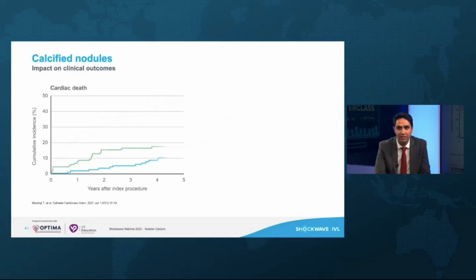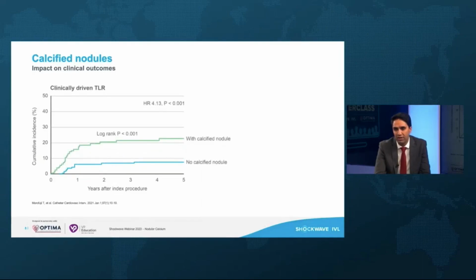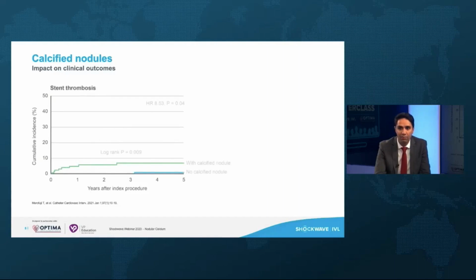And that translates not only to target lesion revascularization, but also cardiac death, clinically driven target lesion revascularization, and importantly, stent thrombosis.